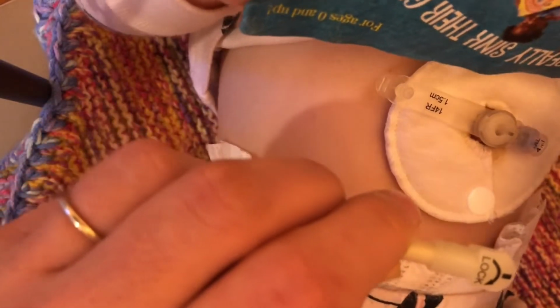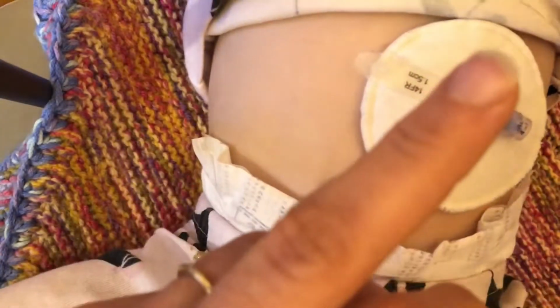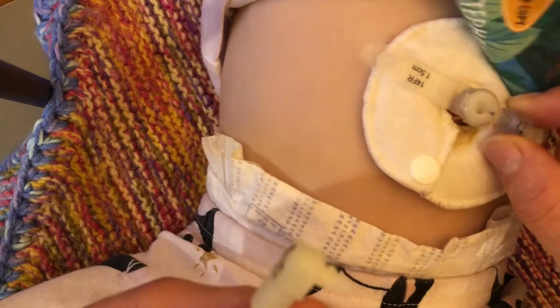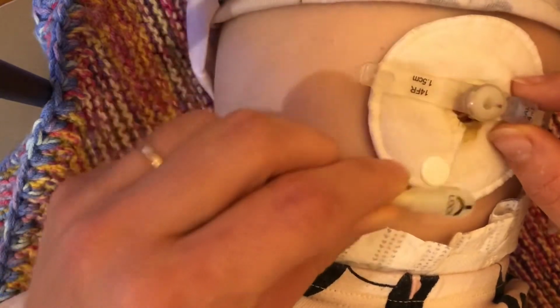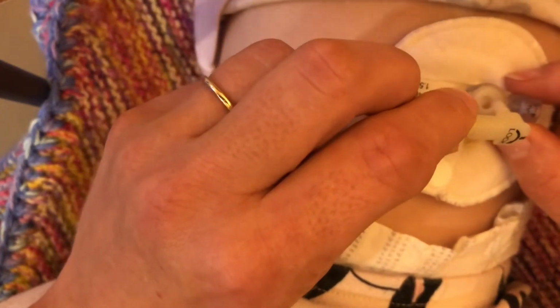Now the thing here, since she does have a lot of granulation, you can turn this tube around. It's fine to turn, it turns all the time. I turn it often, but we try not to just freely move it around and pull it, because it can tend to irritate her a little bit. So I usually just hold it still right here. This is kind of a hard knob, where you would normally fill the balloon with water. So I just hold it steady. You also do have to push a little bit to get this in, so it helps to hold it steady so that you're not just pushing into her stomach. Even though it doesn't really hurt her that much, it just bothers her.